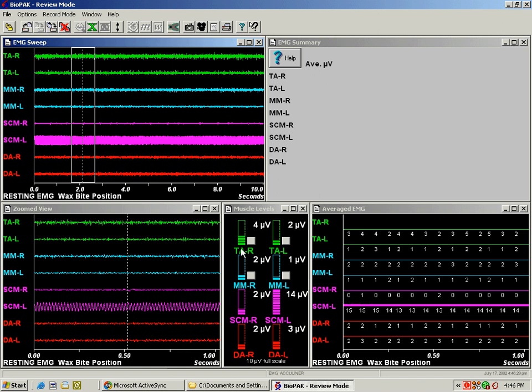The muscle levels, these little pistons here, that indicate muscle activity at the point of this dotted line right here, and the averaged EMG.